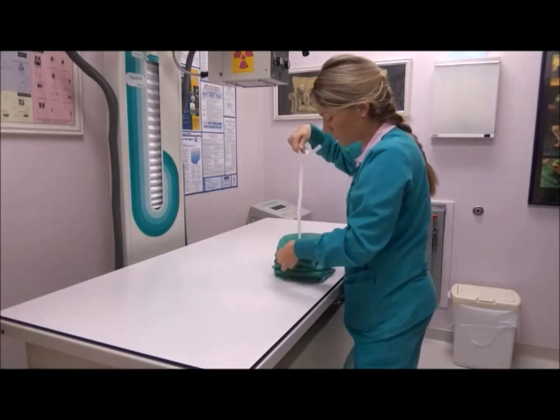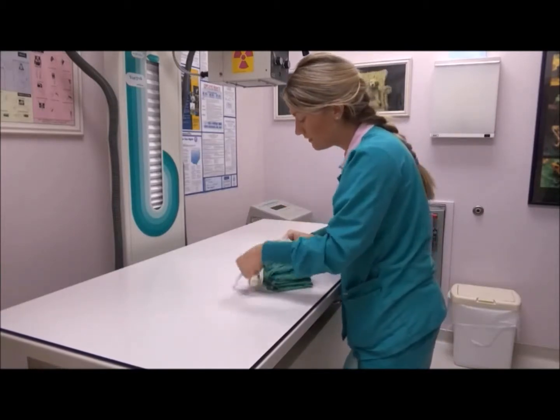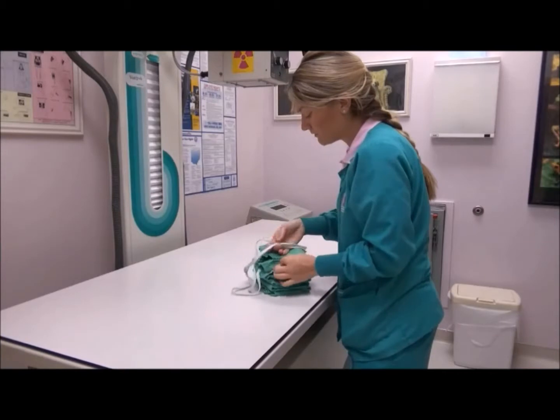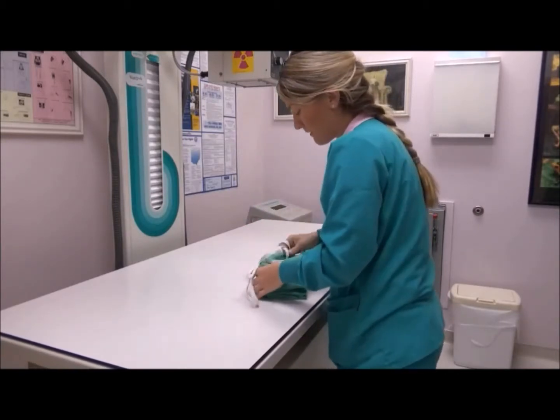And then you always want to make sure that the neckties are right up top, so it makes it easy for whomever's opening the sterile pack. They can just grab the neckties and the gown will come out easily from the pack.